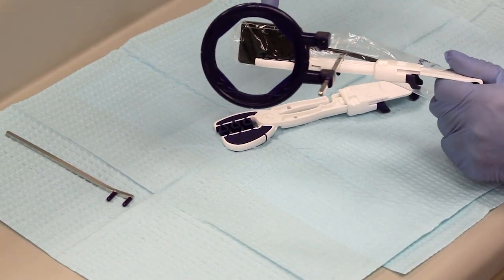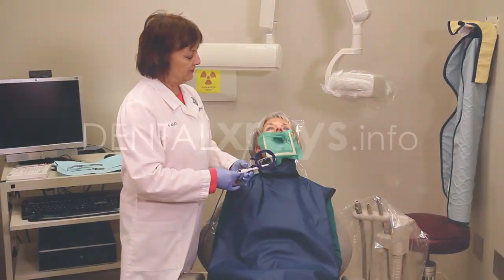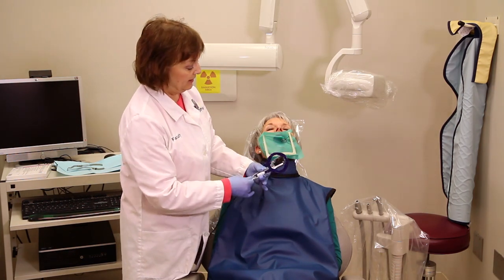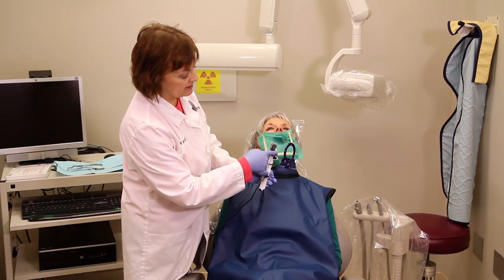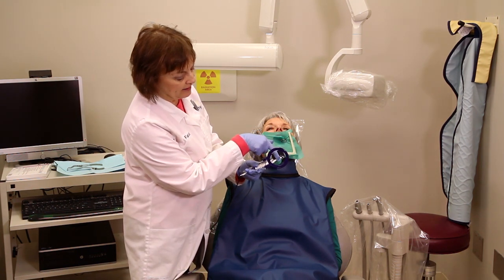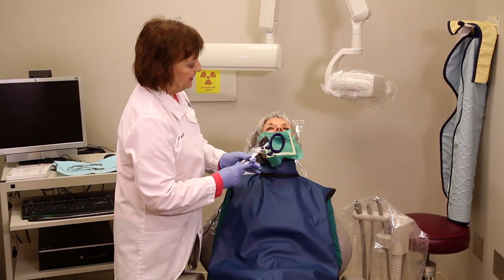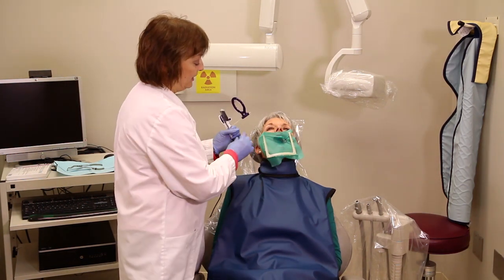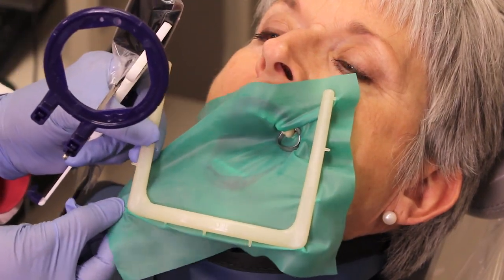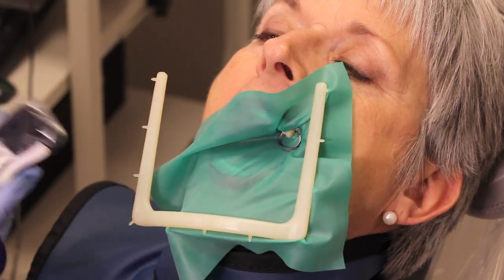Now I'm going to show you how to place this behind the rubber dam that's already placed in Sherry's mouth. As you can see, the root canal that we are doing is in one of the upper premolars. I've got it put together with the cutout of the Snapper on this side to allow for the tooth to come down, and the actual file will not hit anything as she is closing. In order to get this in, what you want to do is actually release one side of the rubber dam and just fold it over so you keep the area clean.